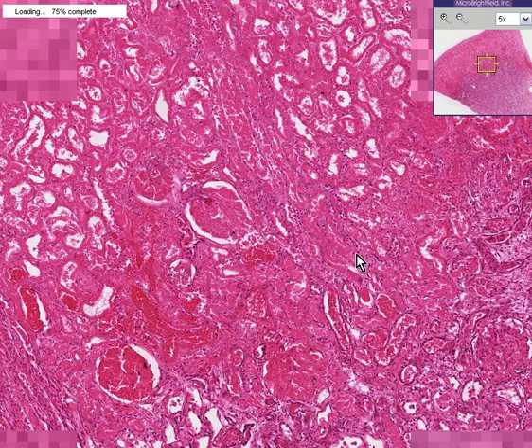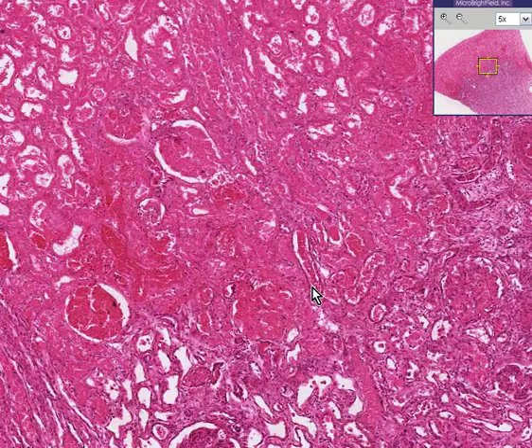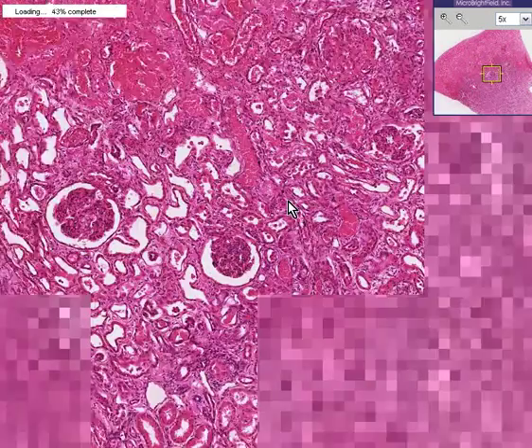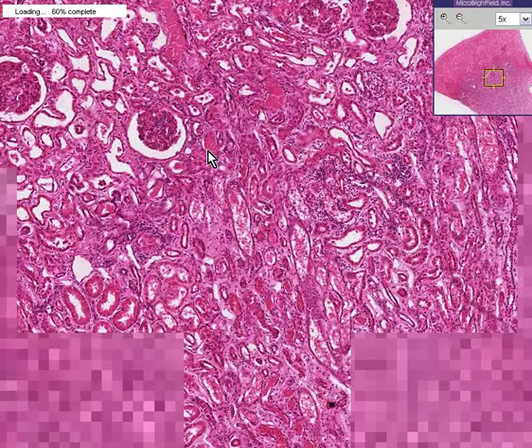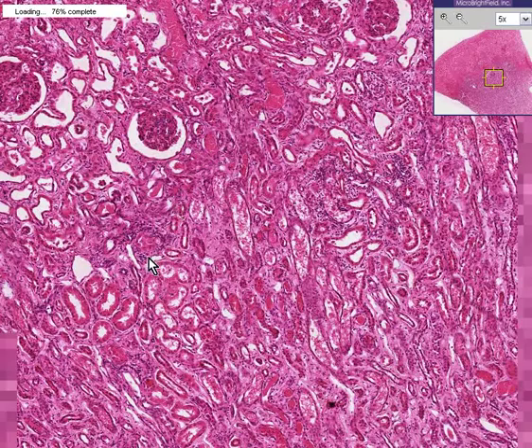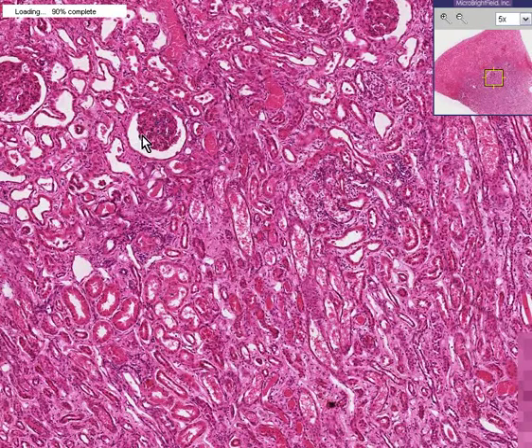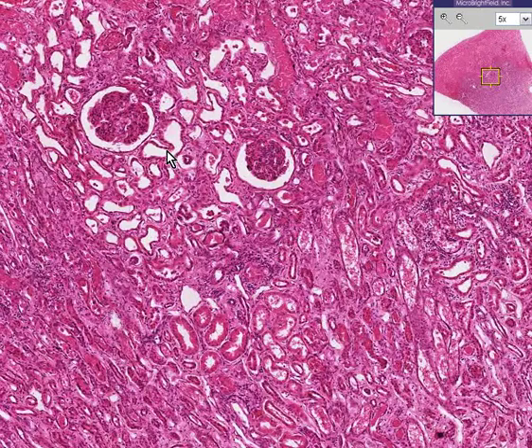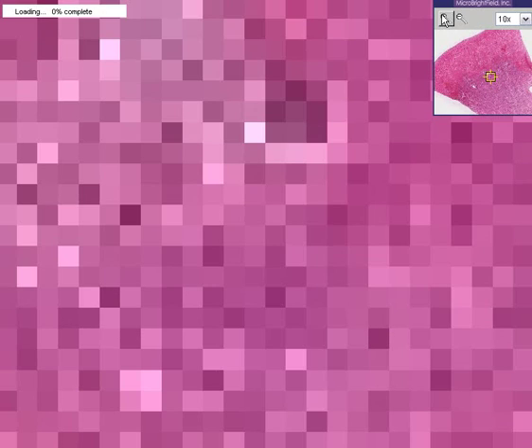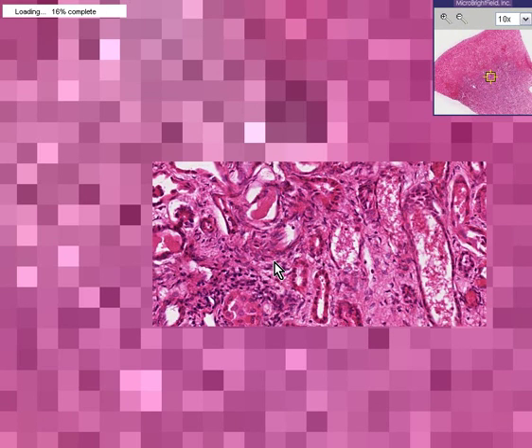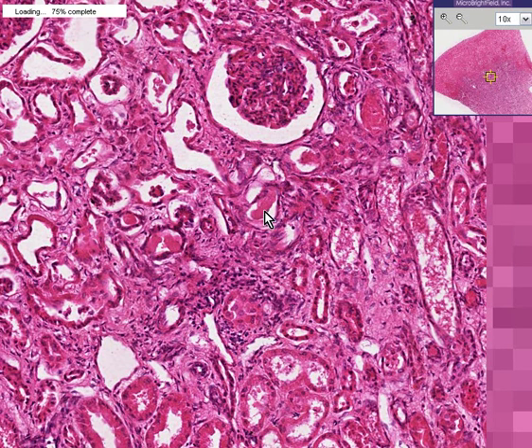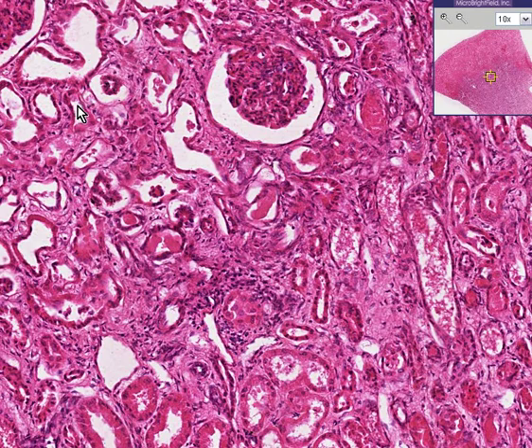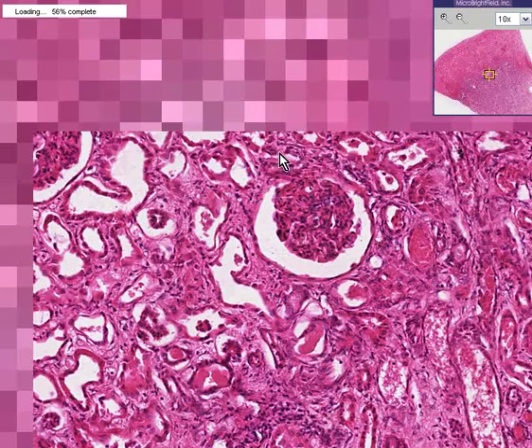Perhaps this could have been secondary to a large infarct. On the other hand, when we go deeper into the more purple or less red or more blue area, we can make out the fact that there are more nuclei within the tubules and within the glomeruli themselves. This is a more relatively normal area in which you could delineate nuclei within tubules and nuclei within glomeruli.